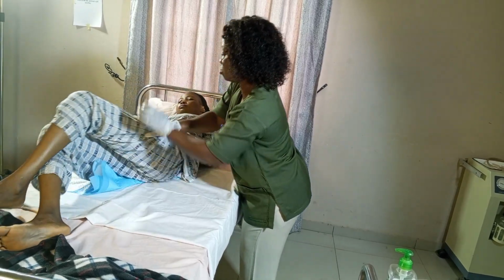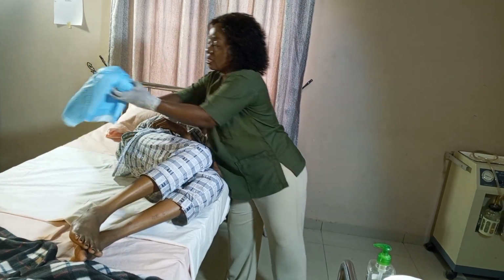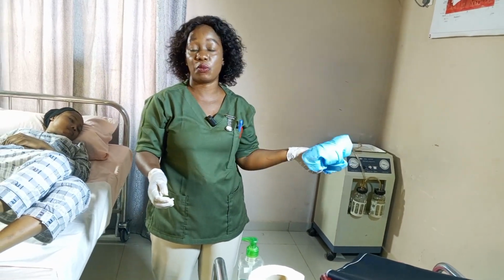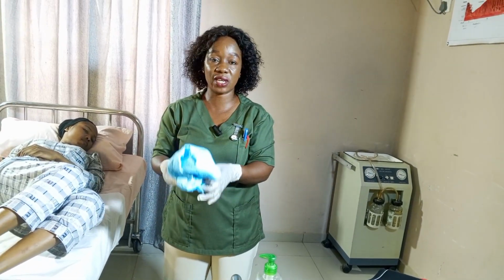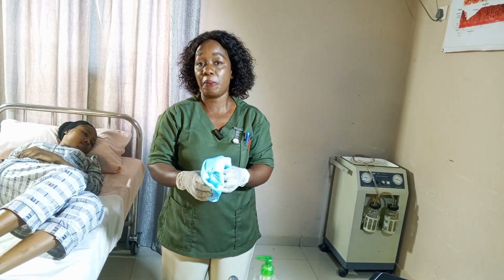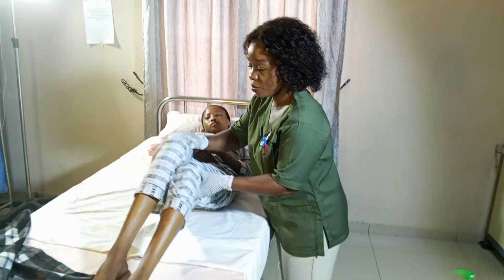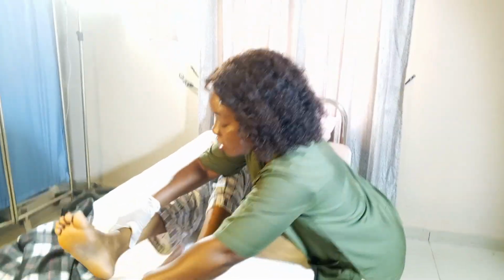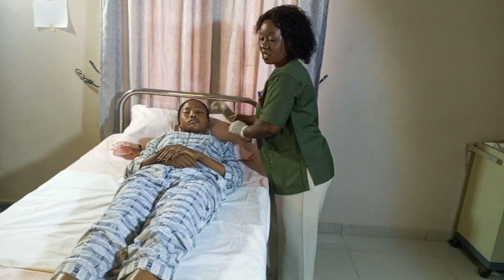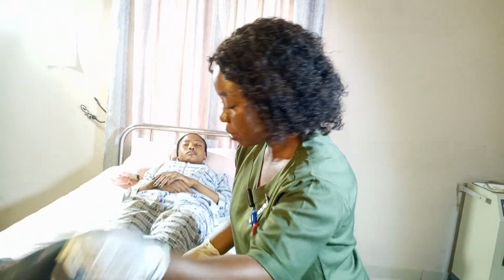And you ask the patient to also turn to your side, and also you discard this in a hamper, right? You discard it in a hamper or inside a bucket, depending on if it's soiled with fecal matter or urine mistakenly or any fluid. You discard it inside a bin for contaminated items, right? The next thing is for me to place my patient in a comfortable position, right? Place my patient in a comfortable position, making sure that she is fine, and tell her to call my attention whenever she needs me.